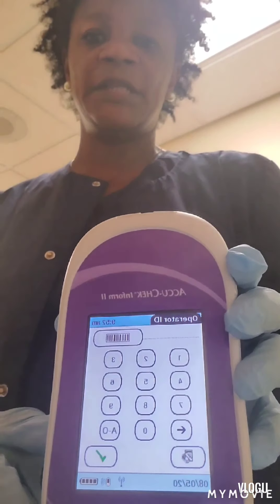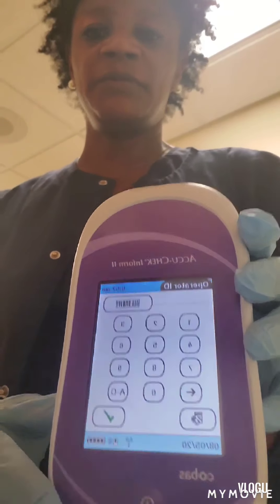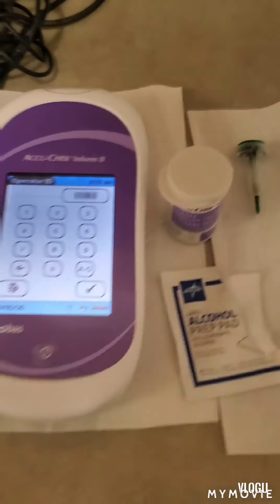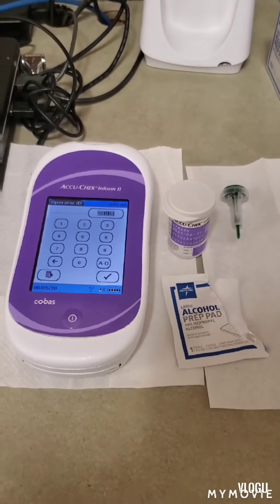The first thing we're going to do is gather our equipment needed to check a patient's blood sugar. We're going to be using a glucometer — in this case the AccuCheck glucometer — a bottle of test strips, a lancet device, and an alcohol pad. So this is how everything looks: all of our equipment for the blood sugar check.